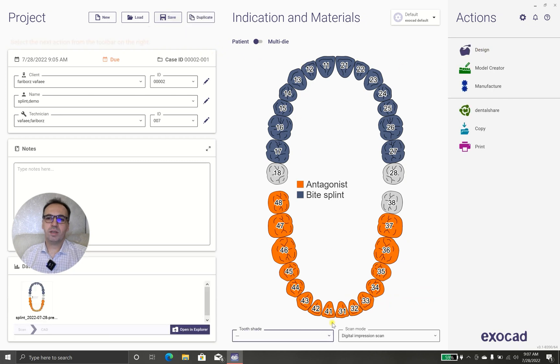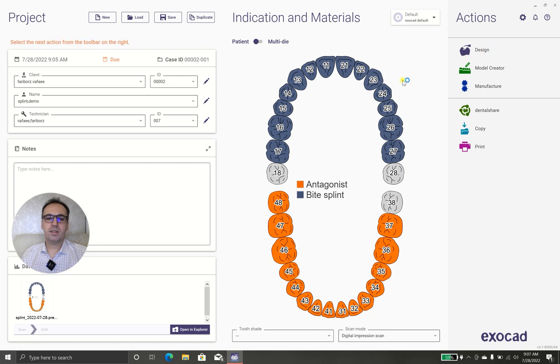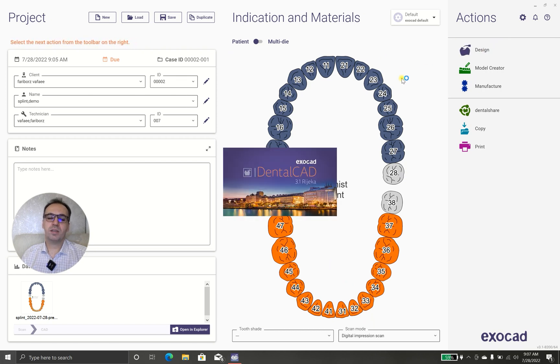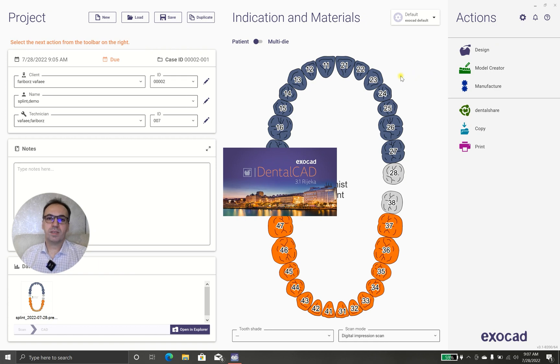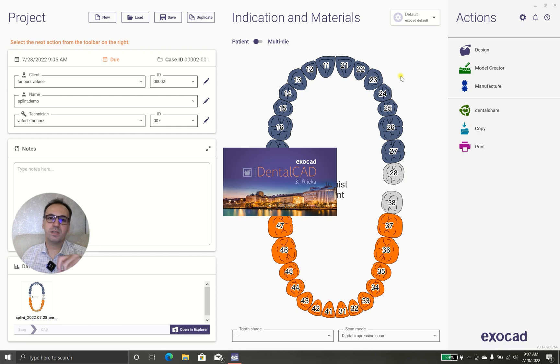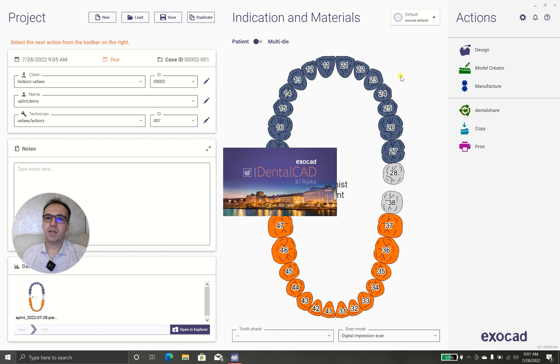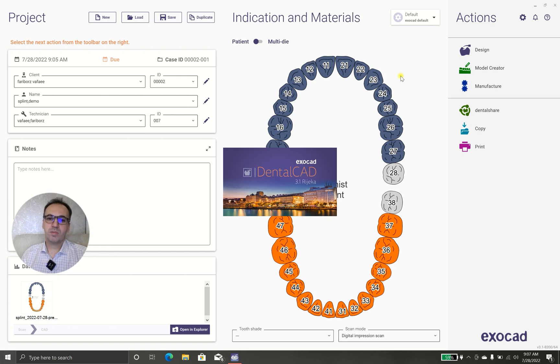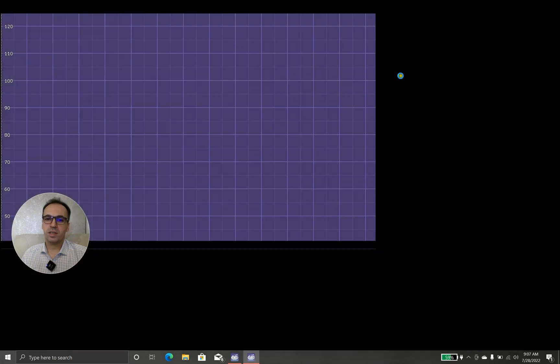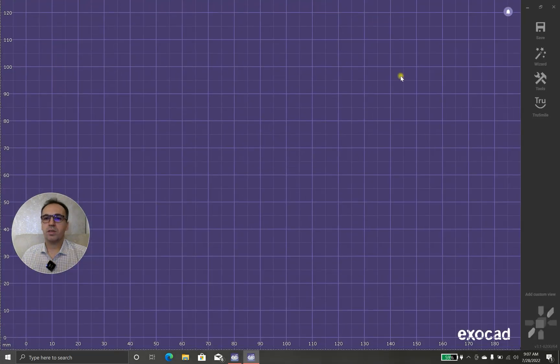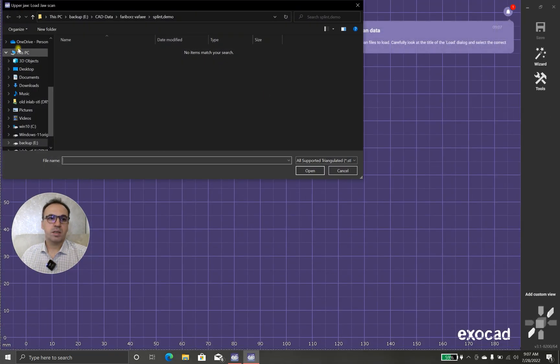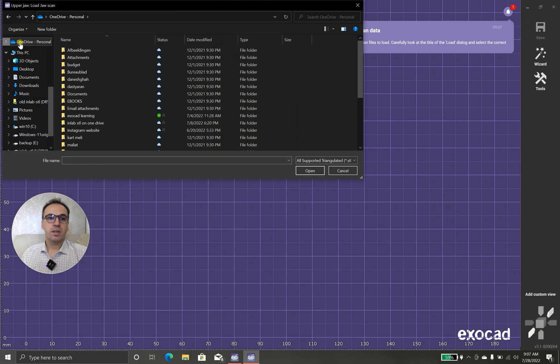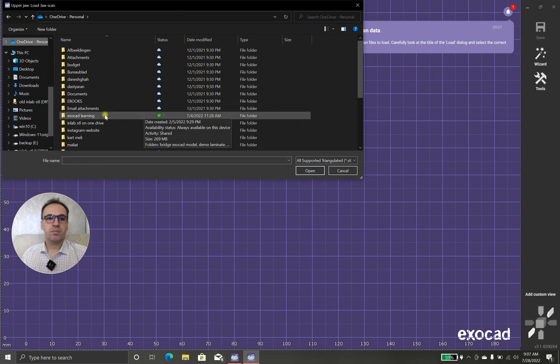It's better to have a clean scan. In case that you made intra-oral scan, it's better to remove the saliva from the top of the teeth. With compressed air, you can clean the teeth. In case that it has some calculus or maybe food remaining on the tooth surfaces, it's better to get polished or scaling before scanning. After we have a good and clean scan, we can go ahead and take a good impression.